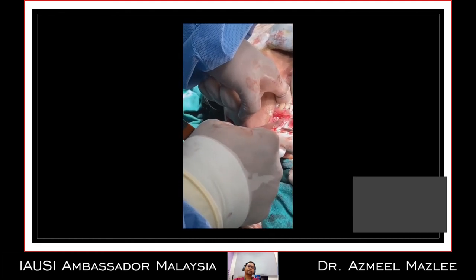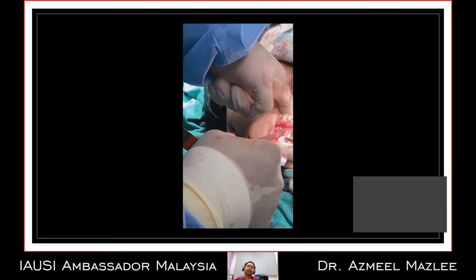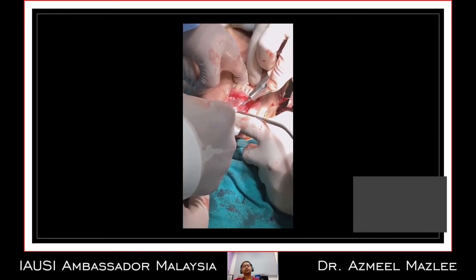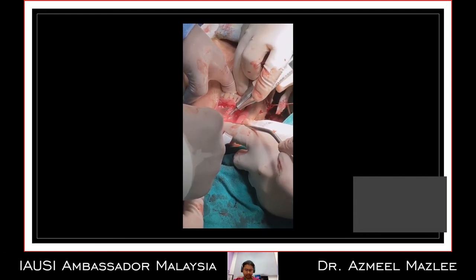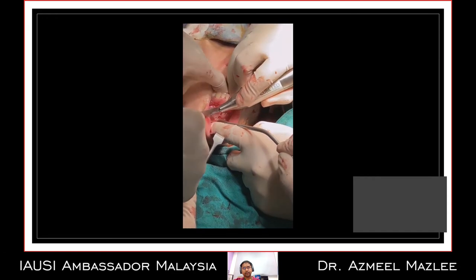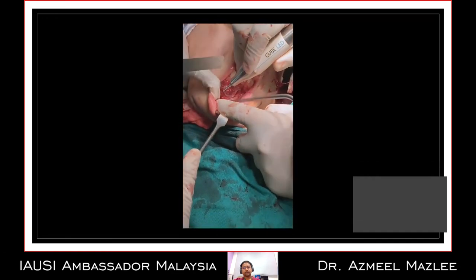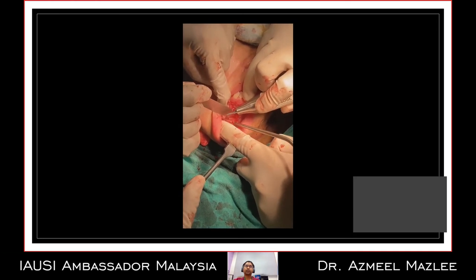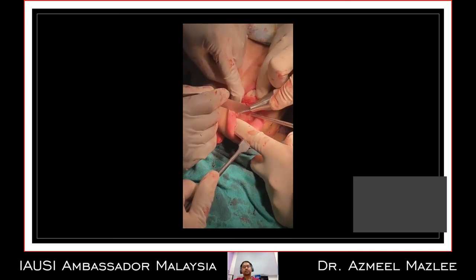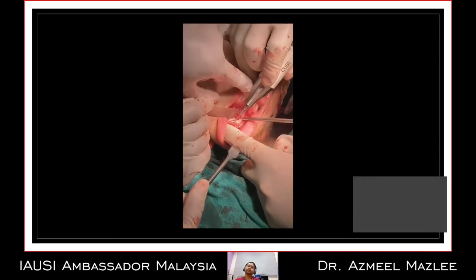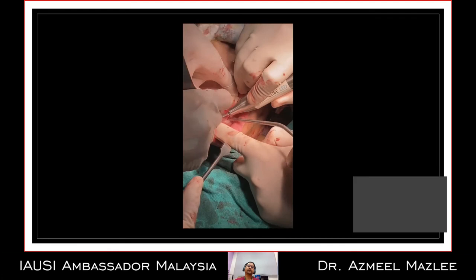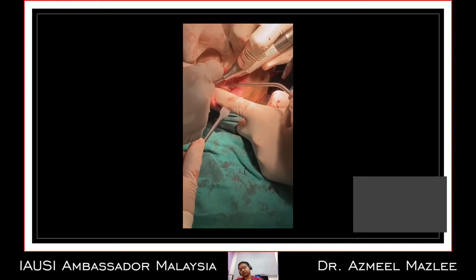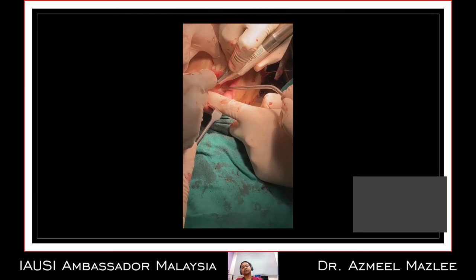From the video, you can see a really precise, fine, and clean cut. Most importantly, it allows preservation of soft tissue, particularly on the lingual side. From previous experience using Linderman or Fischer burr, during cuts towards the lingual plate we might accidentally cut into the mylohyoid, geniohyoid, or genioglossus muscles, leading to massive bleeding. By using the piezotome, it creates very smooth cutting with preservation of soft tissue.